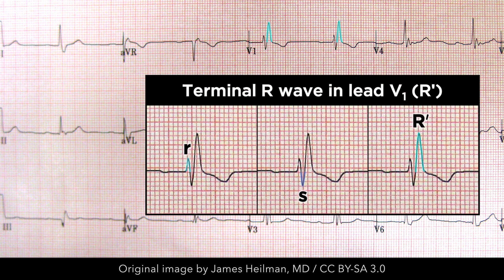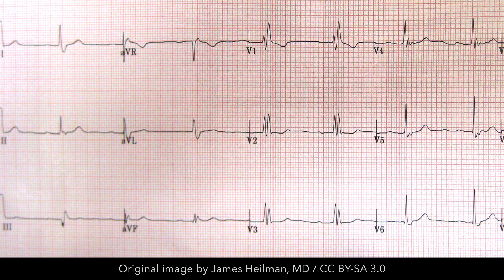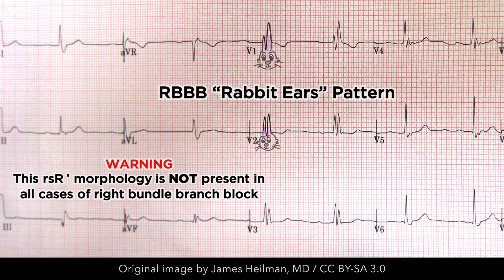The QRS complexes in right-sided leads have a large terminal R-wave, R-prime. The initial portion of the QRS complex depends on the orientation of the heart and the intricacies of the conduction block, but typically involves a combination of R and S-waves. The most characteristic wave morphology is RSR-prime, as seen in this image. This morphology is commonly likened to a pair of rabbit ears. With an RSR-prime wave, a small R-wave is followed by a small S-wave before terminating with a large R-wave, R-prime.